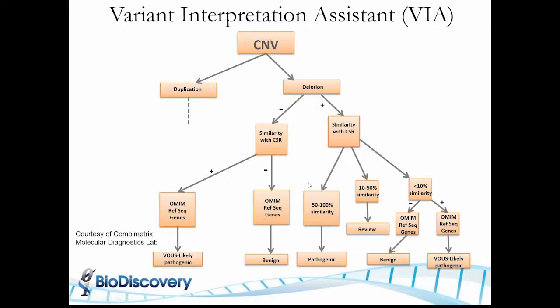But the language or the setup that we have here is quite comprehensive. You can have it based on the phenotype of the sample, based on the regions of the chromosome, based on similarity to OMIM or ClinGen, etc. So you could create a very sophisticated interpretation algorithm that consistently generates the same pre-classification and brings attention to areas that need to be looked at quickly.